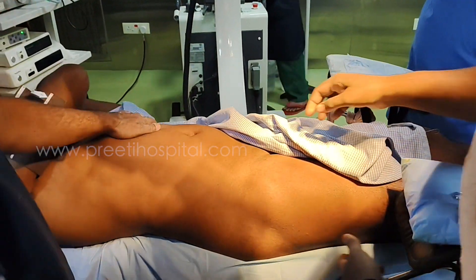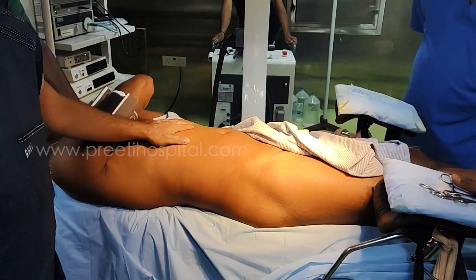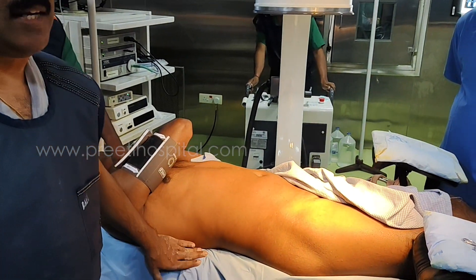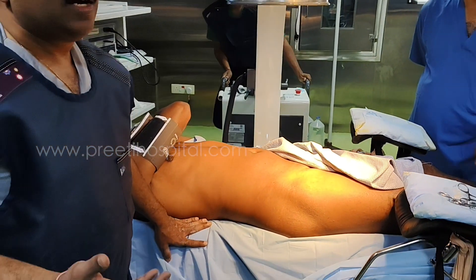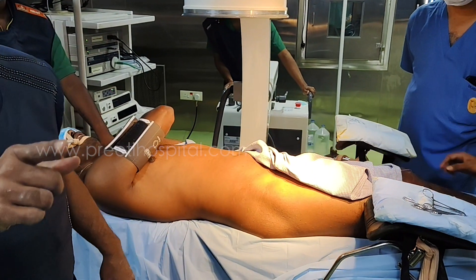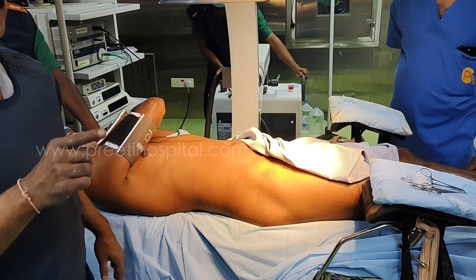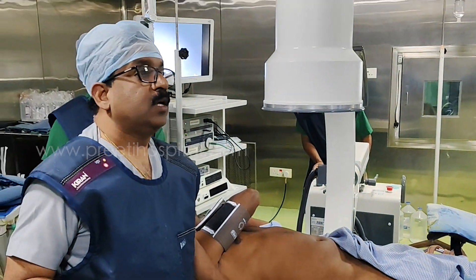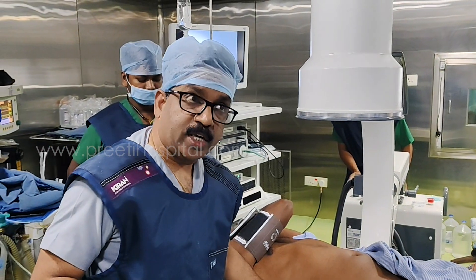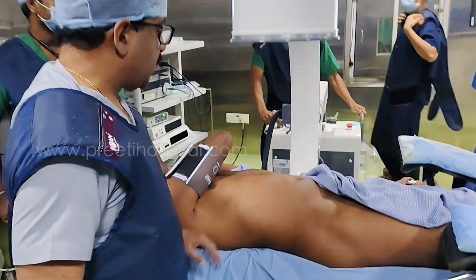At the edge of the table — it is a basic principle. What is wrong if you keep at the edge of the table? Nothing wrong. Even if you don't keep at the edge of the table in supine PCNL, there is no problem. I will tell you why.